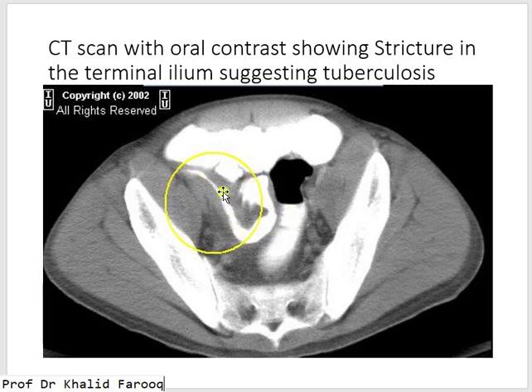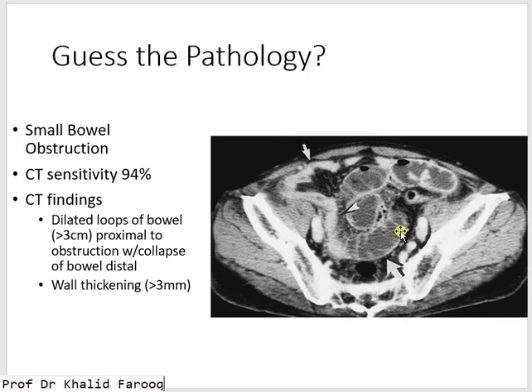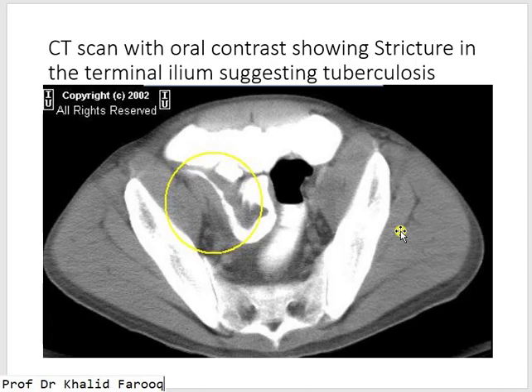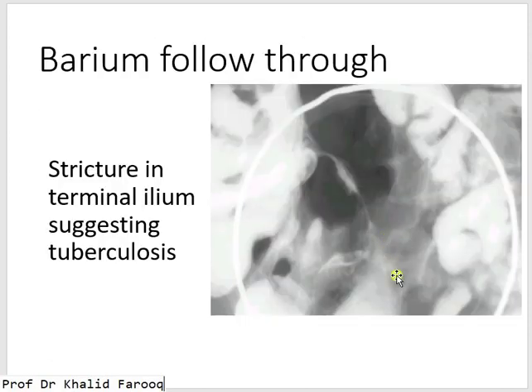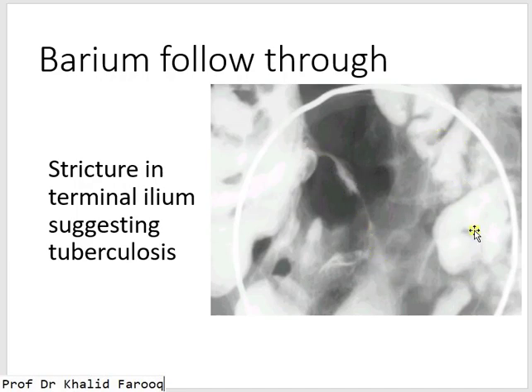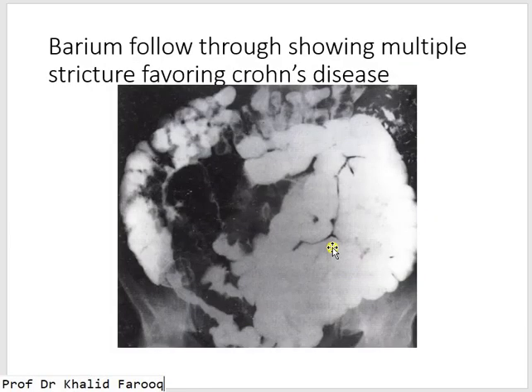Another CT example shows oral contrast within the small intestine, with the terminal portion showing a stricture with thickened surrounding walls — another example of ileal or ileocecal tuberculosis leading to intestinal obstruction. On barium follow-through examination, a tight stricture involves the terminal ileum, with the cecum and proximal small intestine visible. This stricture leads to hold-up of contrast in the proximal small intestine, and the etiology is tuberculosis.